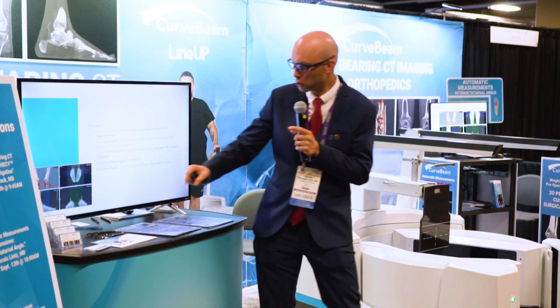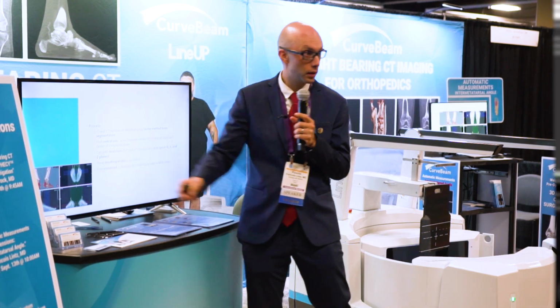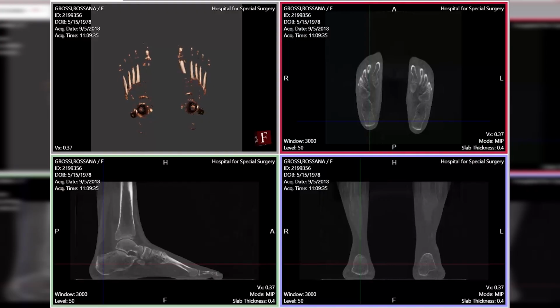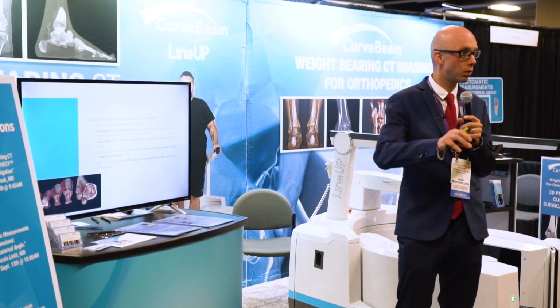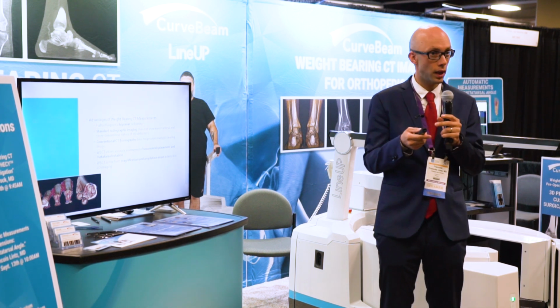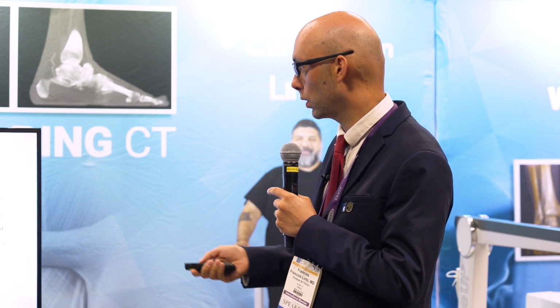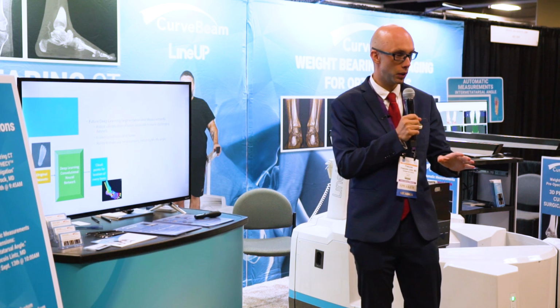So the angles show on the 3D rendering view and on the projected digitally reconstructed radiographs. So if you really want to relate to what you know and what you're used to, you're looking at the 2D radiographs. So the advantage is that it really helps with hallux valgus. It doesn't tell us what the rotation of the first metatarsal is, but it's definitely a future development. It's only a case now of teaching the algorithm with more data sets, more information, and it becomes more efficient as time goes on.